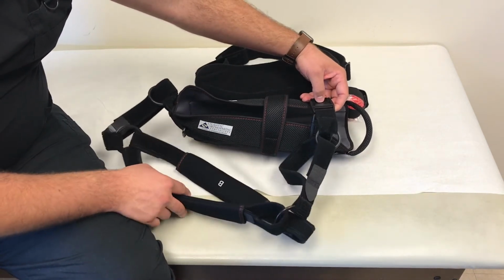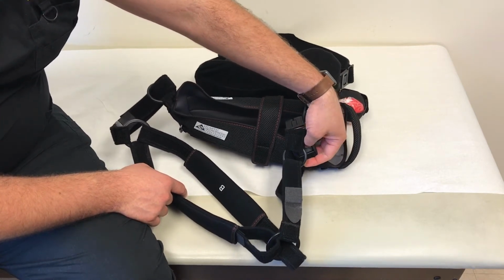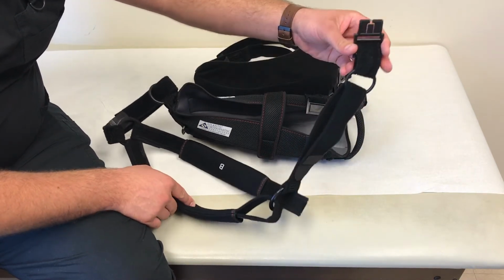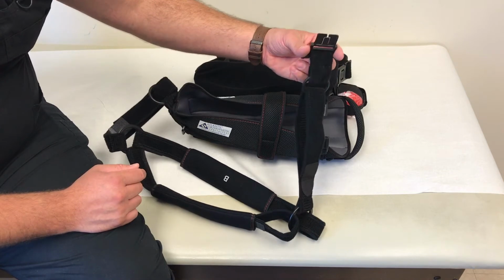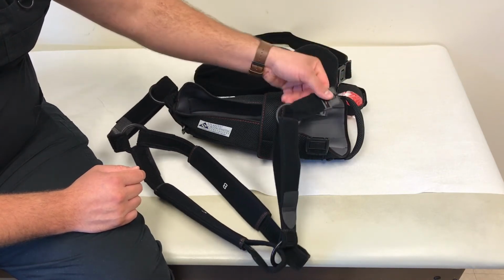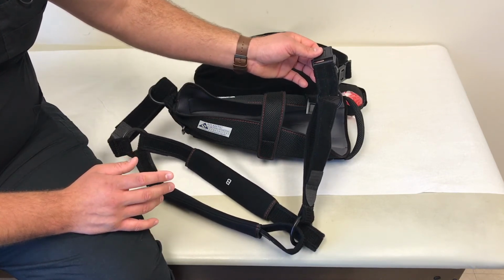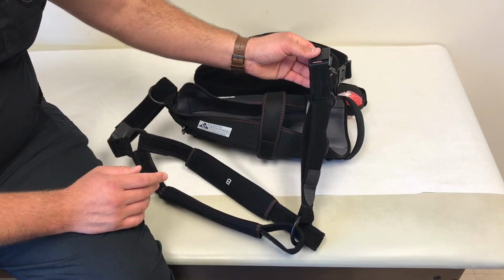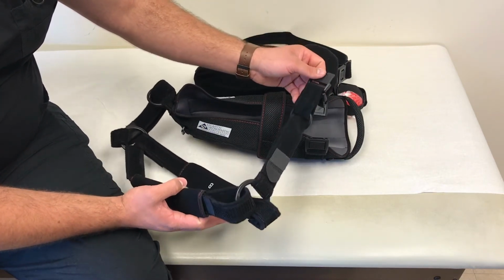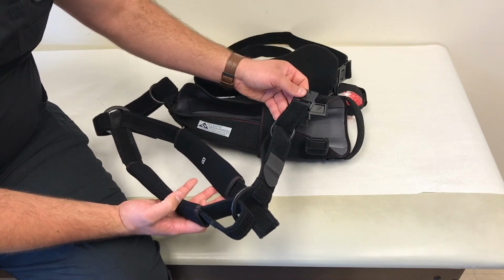Like I said, the clips on strap A are pretty much the most essential to the whole system. And they unclip very easily. I was able to do that with just one hand. And they have 2 teeth right there that clip back on. And these are the only thing that you really need to touch when taking your sling off and on. After you, I should say that's after you have adjusted everything to make it fit you perfectly.